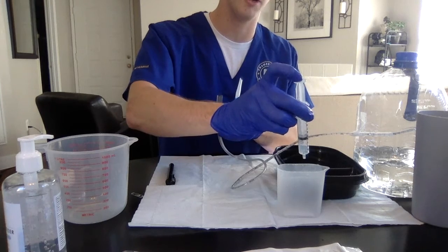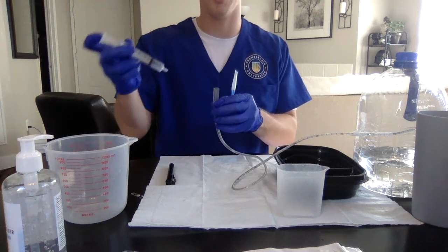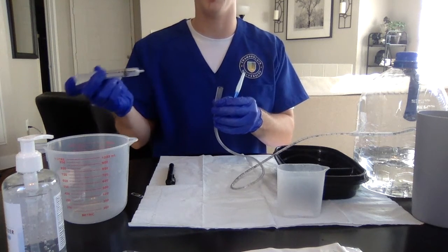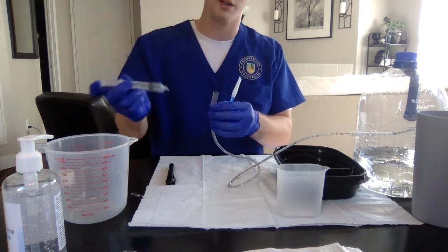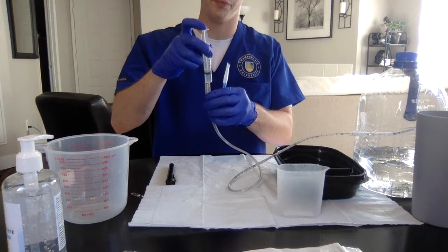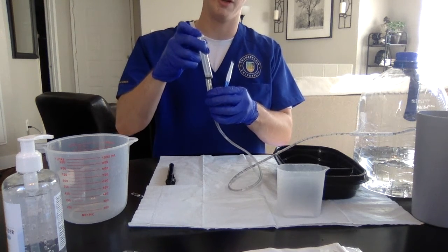So we're going to do about a drop or two onto the pH paper, and we want to compare it with the charting for it, and we want it to be around 3 or 4. Not around, we want it to be 3 or 4. So now the rest of our gastric juices, we're going to insert back in here. Make sure we get all that in.